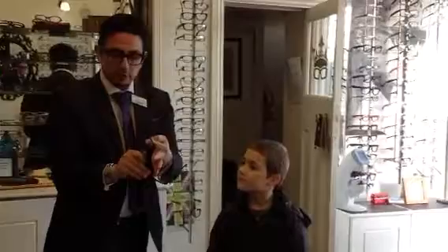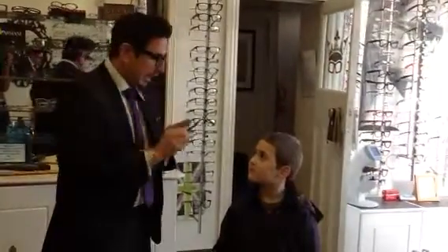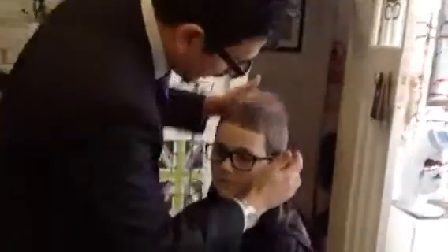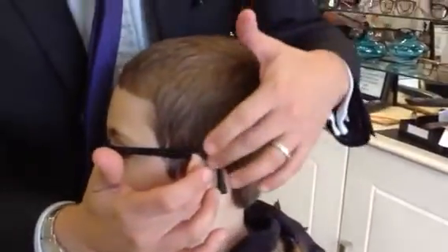Then, with your finger, you support the back and you bend it. And then once it's on, come a little bit closer — I'm going to look behind the ear. Can I look behind your ear? Make sure it's not too tight. And it shouldn't be at a 90 degree angle — that's bad. It should just fit cosily around your ear there.